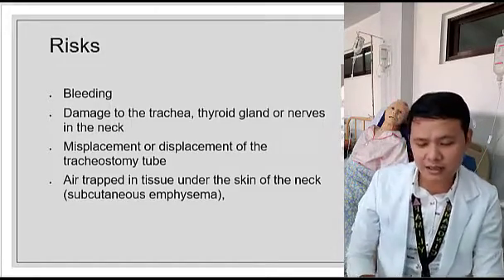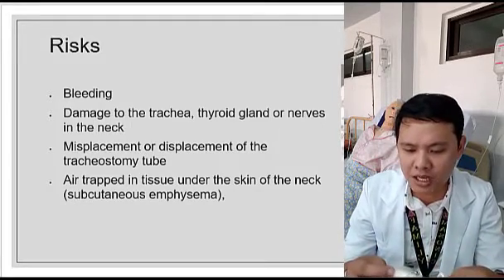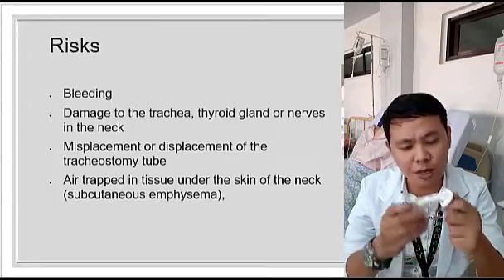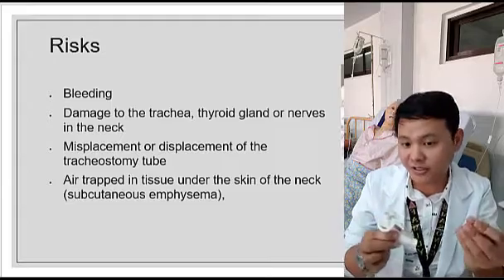And then later on, sadly, kasi hindi na siya naagapan, nagkaroon ng atelectasis. So, it's really important, guys, na secured po yung pagpe-place natin ng tracheostomy, and then there's proper care. Don't worry, I'll teach you guys how to properly care for the tracheostomy.